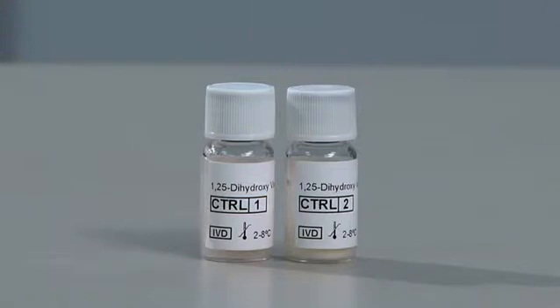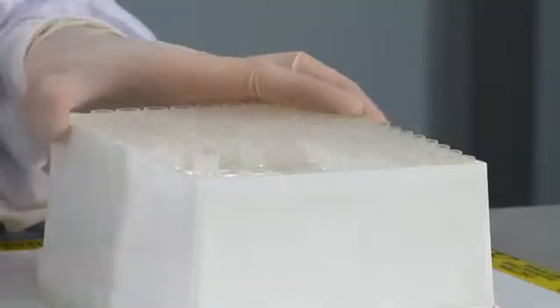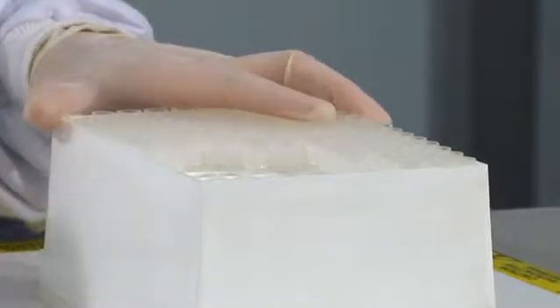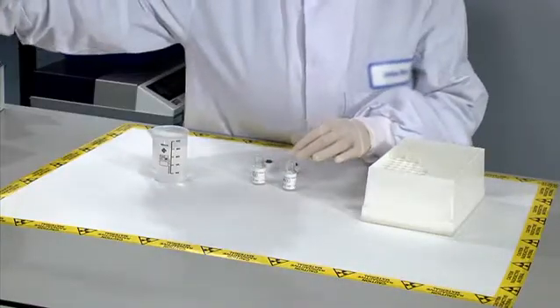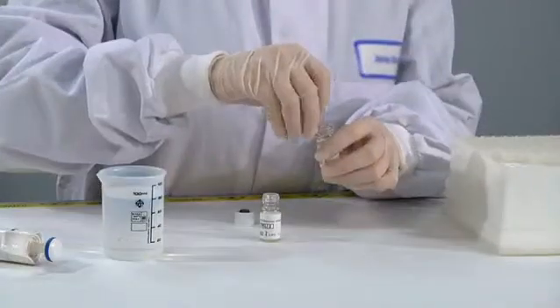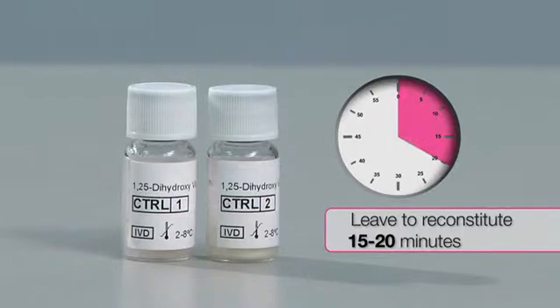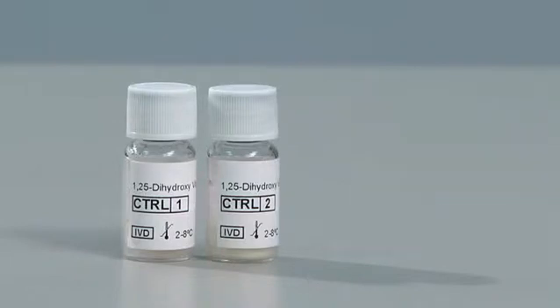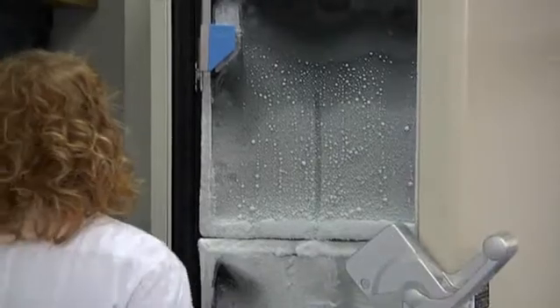Reconstitute controls immediately before use. To prepare the controls, pipette 1.2 milliliters of distilled or deionized water into each vial. Replace the stoppers and leave for 15 to 20 minutes to reconstitute. Invert several times to ensure complete reconstitution. If controls are to be used more than once, freeze within 15 minutes of reconstitution at minus 20 degrees Celsius.